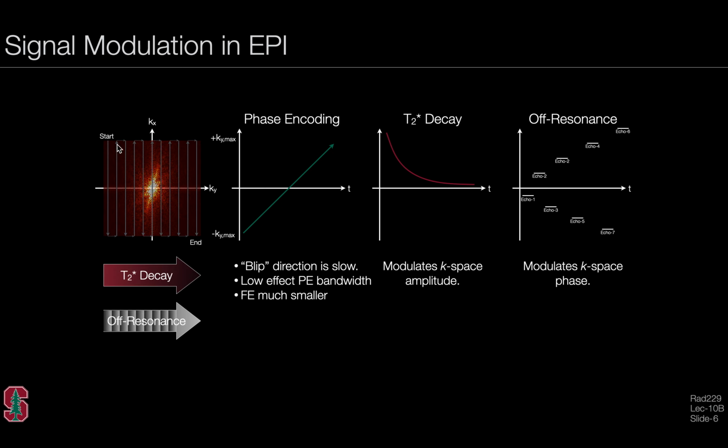Here we've changed the readout direction, or the phase encode direction, to be left to right. So we're starting our K-space acquisition in this corner here, and we're sweeping in a zigzag trajectory, or an echoplanar trajectory, towards the bottom of our KY trajectory. Now recall, from the beginning of excitation, the transverse magnetization will decay as a function of T2 star, and so the echo amplitudes are getting ever smaller as we go from, say, the top of K-space to the bottom of K-space.